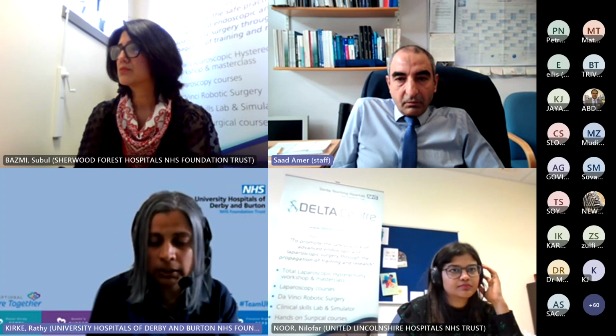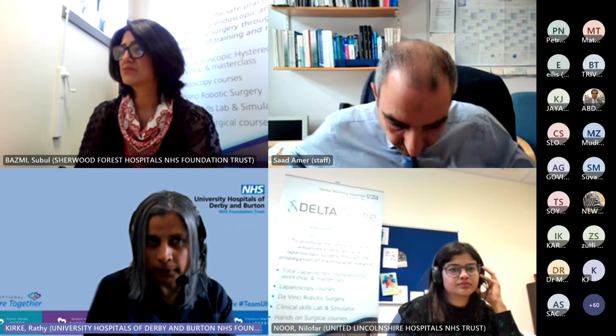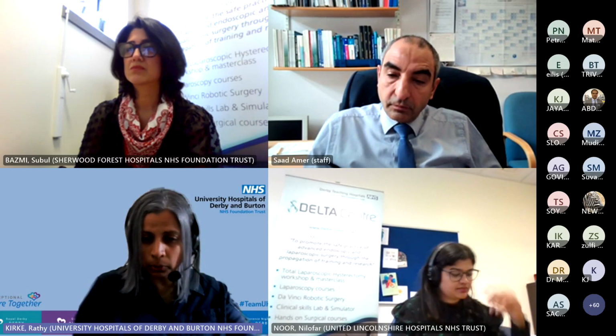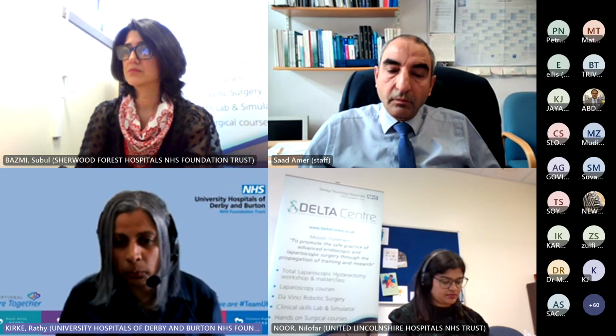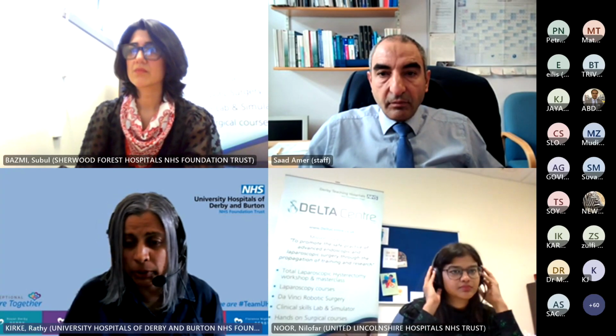I don't think we could do this with ultrasound, I'll be honest with you. I think this is something that we do with MRI. We do a T1, T2 whole pelvis from the iliac crest down to the perineum, so we do a whole mapping of the pelvis. We look at those images when they come out and see what doesn't look right. And as I said, we've got the luxury of looking at the images as they come out of the scanner. So we try and do our best.